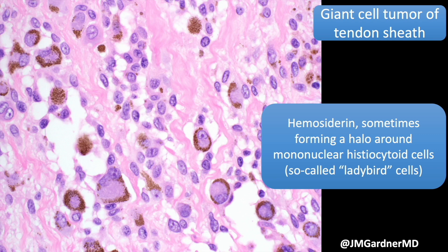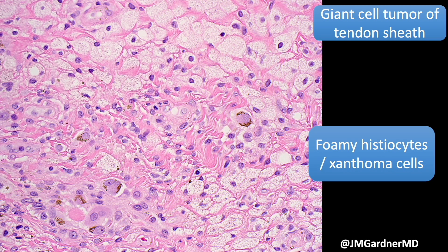Some people have called these 'ladybird cells' — in the United States we call those ladybugs. To me they look like halos of hemosiderin, but other folks have called them ladybird cells or ladybug cells if you're American. Also look for foamy histiocytes, or xanthoma cells — not always present, but oftentimes you'll find them.